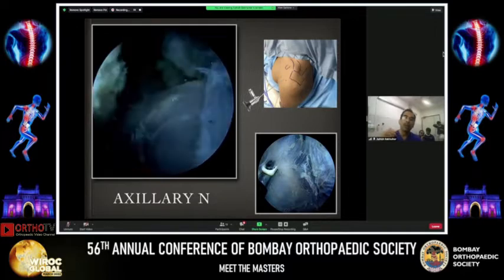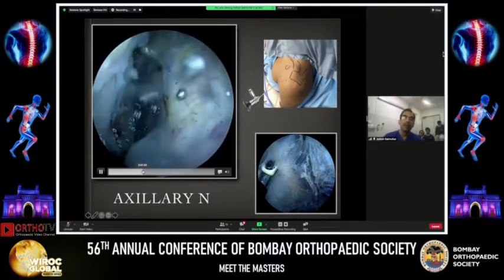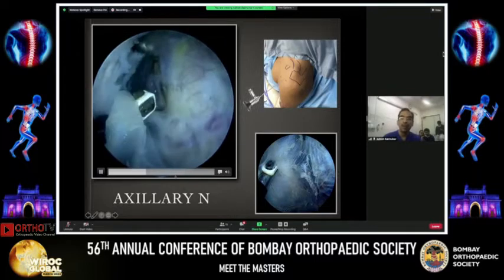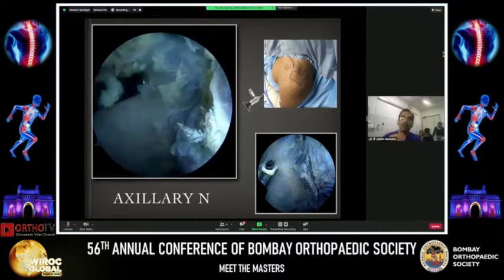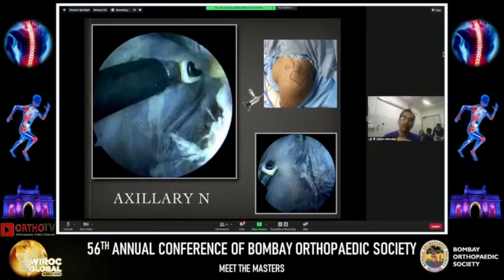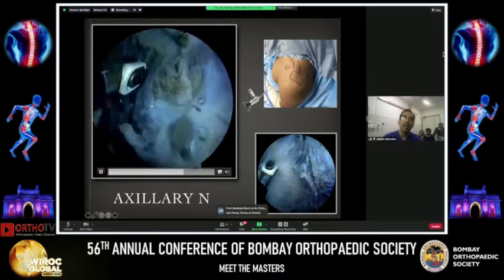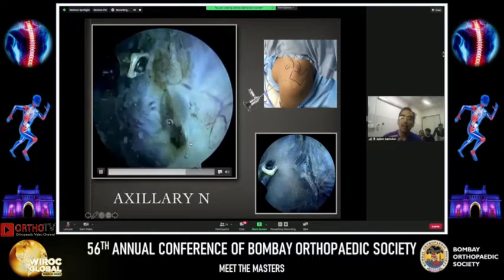This is my Vissinger rod coming in from the top D portal — the high anterior portal. It will come in underneath the conjoint, lift it up so that we can get a fair picture. You can see my rod come out here through the split, just to mark the split. Up here at around nine o'clock, we expect to see the axillary nerve. Progressively use the back end of the radiofrequency without pressing the coag or cutting buttons, just use it as a probe to remove the fascial tissue, and then you should see a nice white broad structure — the axillary nerve.